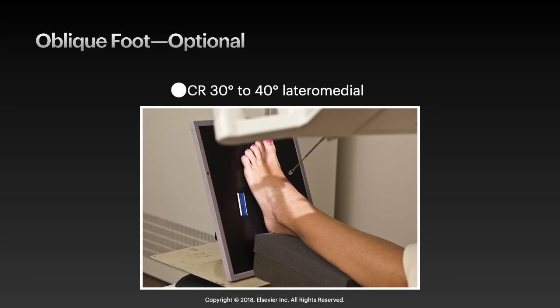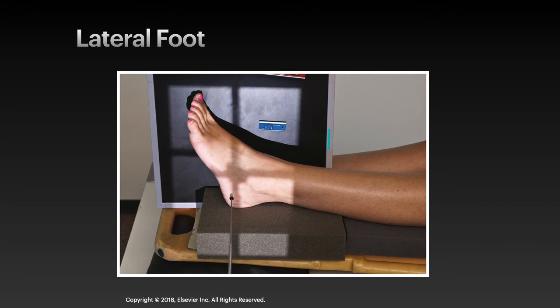Oblique foot, optional for trauma. The CR is angled 30 to 40 degrees lateral medial. Lateral foot. Using a horizontal beam, the CR will enter laterally instead of medially for the lateral.